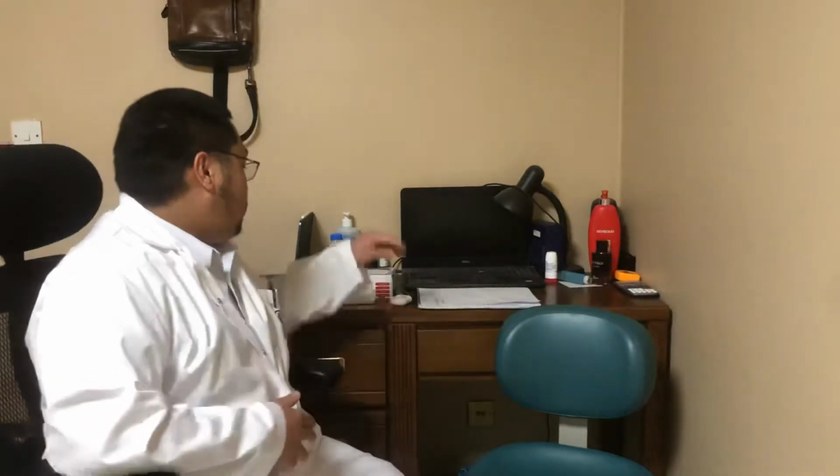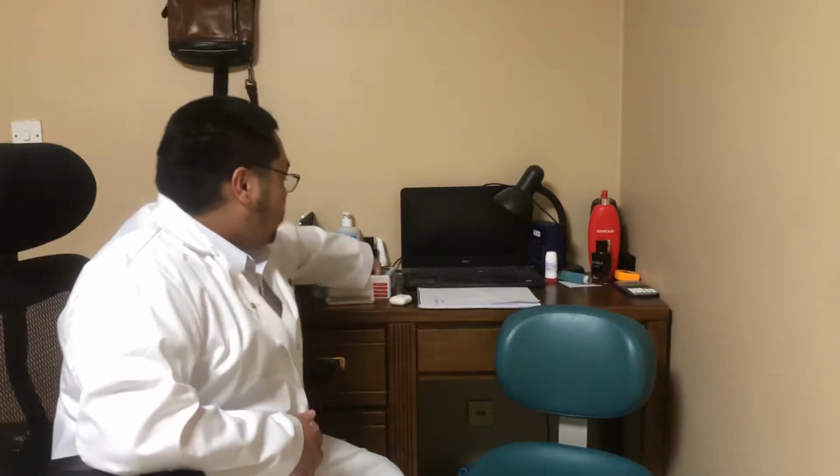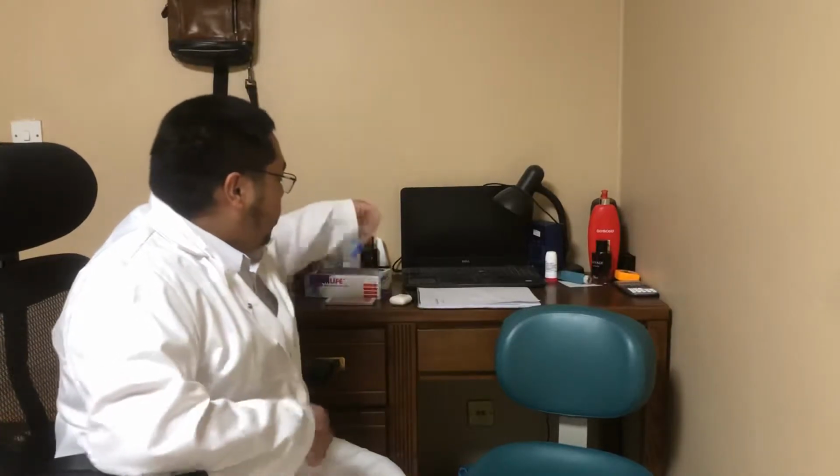Today I'm going to be performing the return demonstration of a temperature, one of the vital signs of a patient. So first, before performing the return demonstration, I'll have to explain what a temperature is. A temperature is the difference between the body heat's loss and production that is measured by a thermometer. There are a lot of thermometers, but in this return demonstration, we're going to be using a mercury thermometer.